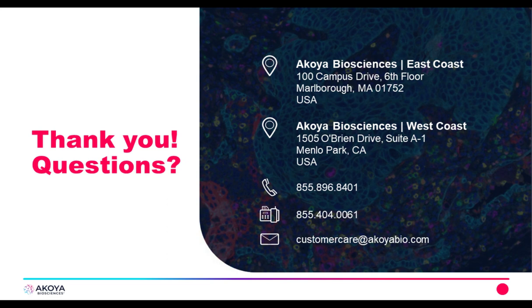Sure, that's a great question. Internally we've tested 16 cycles without seeing a loss of antigen detection. I think a paper was recently published using CODEX where they tested 33 cycles and saw no loss of detection of the target antigen. So I can say very confidently that we do not see a loss of signal in the ability to detect that target antigen.